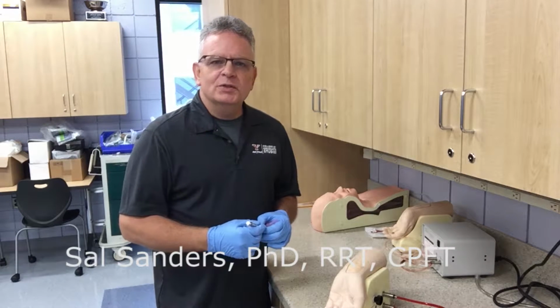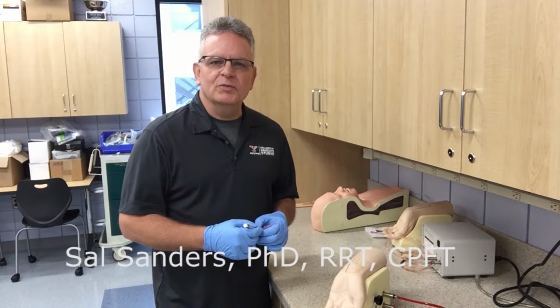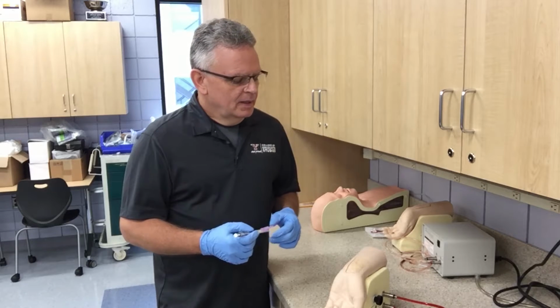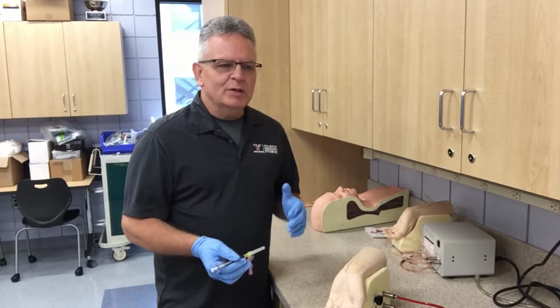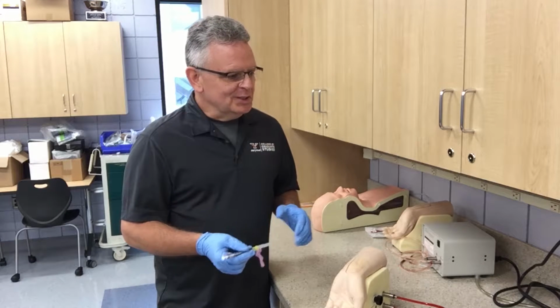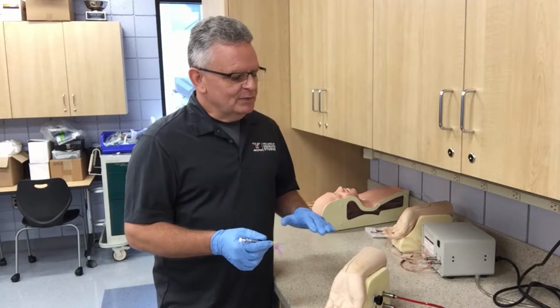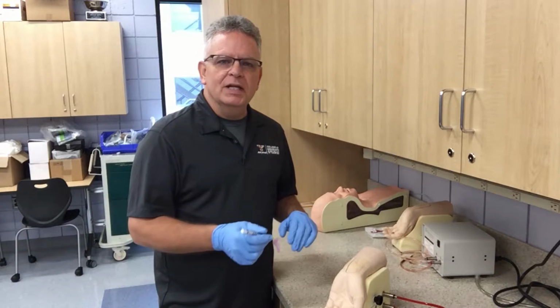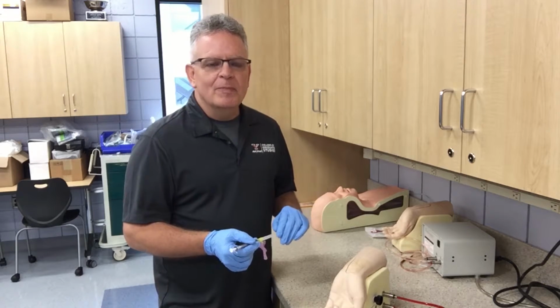It would be my pleasure to demonstrate an alternative technique for palpating and targeting the radial artery during arterial blood gas sampling. This is very important because having an arterial puncture procedure done is uncomfortable enough if you manage to get the sample on the very first attempt. And in some cases, if you have difficulty properly palpating and making that initial approach, you may need multiple attempts to get that sample.